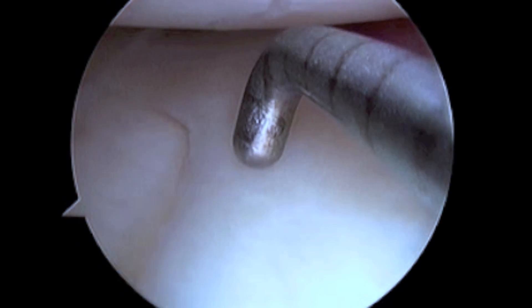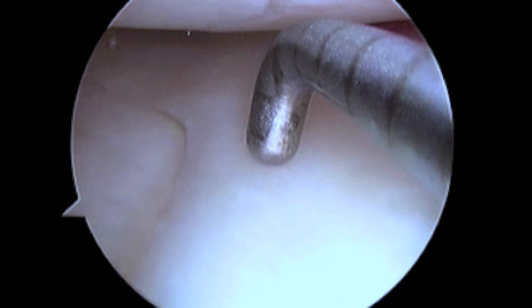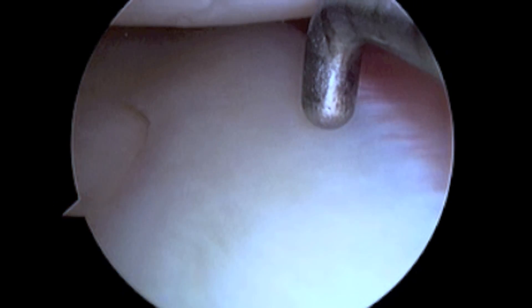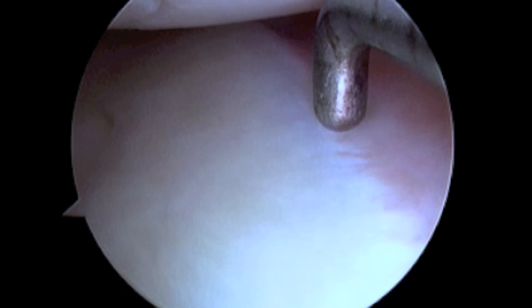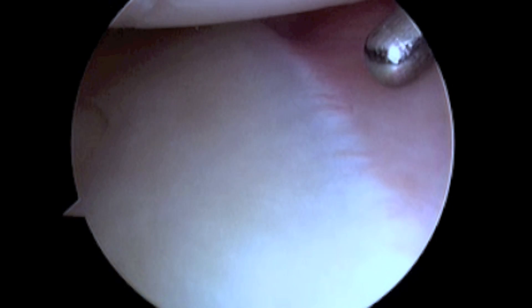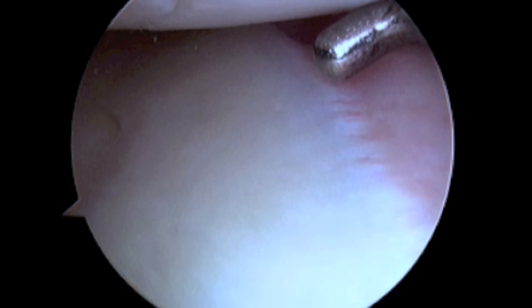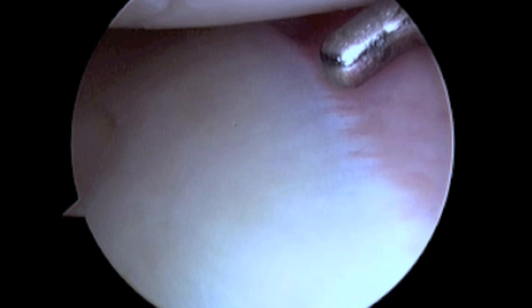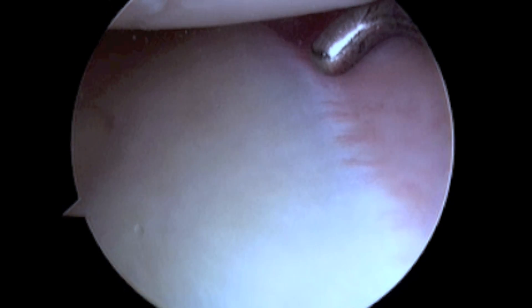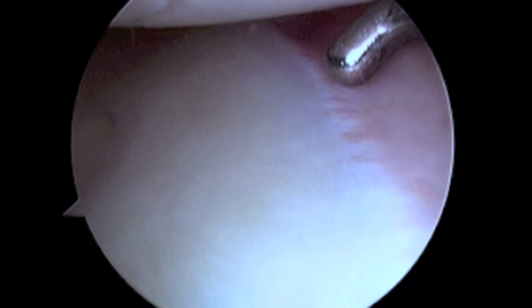As demonstrated in this healthy meniscus, the inner rim has a poor blood supply and a relatively low healing potential. The blood supply to the meniscus begins at the outer periphery as indicated here. Tears within three millimeters of the meniscocapsular junction have an adequate blood supply and an improved healing potential. Unfortunately, tears more than six millimeters from the peripheral blood supply are generally considered avascular and are not suitable for repair.